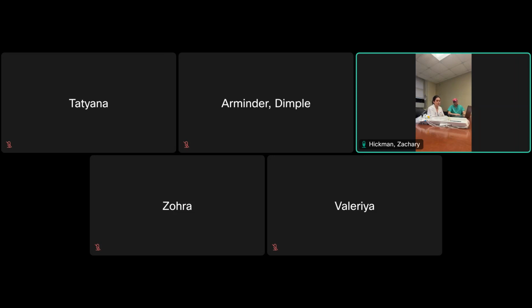It could be blood, tumor, inflammation, anything that obstructs the circuit of the CSF, or blood or any sort of leptomeningeal disease that also interferes with the ability of the arachnoid granulations to reabsorb that CSF, right? So in any case, there's a buildup of CSF that the patient cannot drain appropriately. So we help them by placing an external ventricular drain.